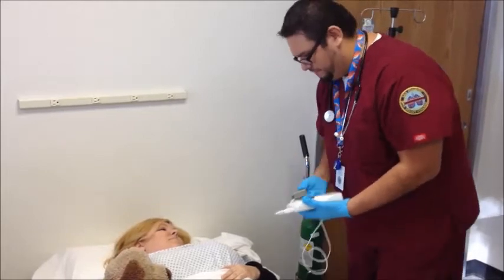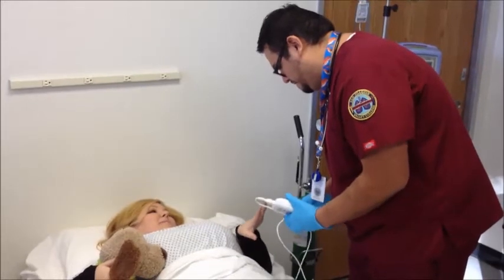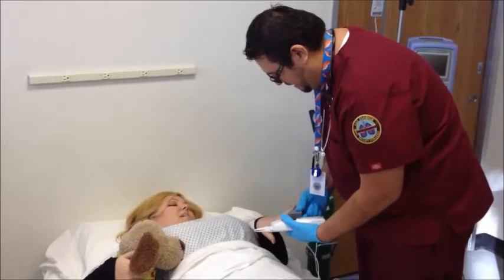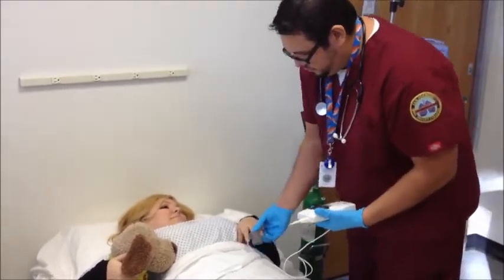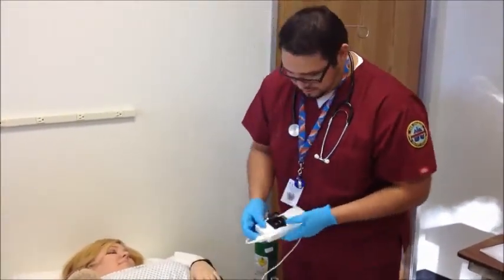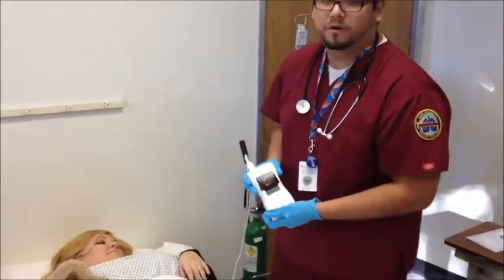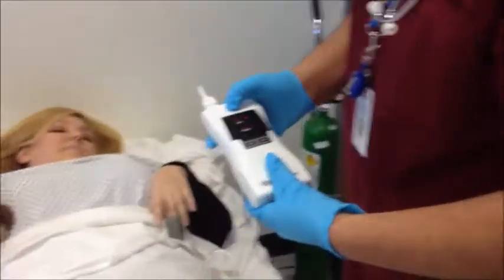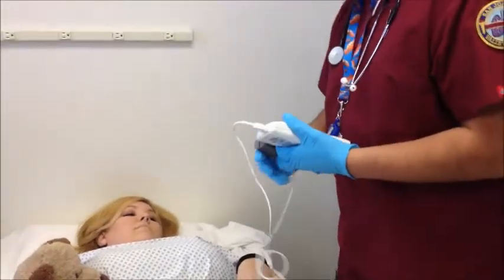First thing you want to do is get your finger right here. Which finger? Get your middle finger right here — the biggest one. It's just easier to get a reading on the longest finger you have. What you want to do is place it on the finger, put the picture of the finger facing up, and go ahead and hit the on button right here. It will measure your pulse and should give us an O2 reading on our stats. It looks like it's reading at 65%. That is pretty low.